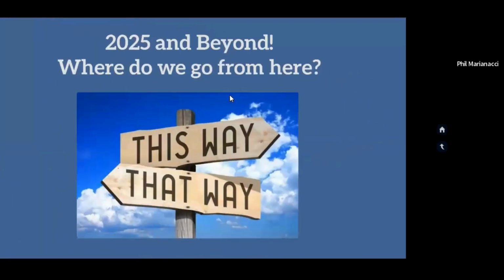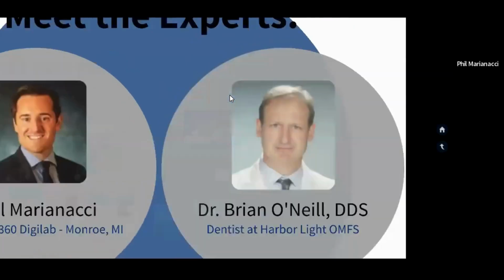Okay, so what am I looking to do in the future? I'm looking to integrate things that will attract doctors' value. It's as simple as that. It might be communication, which is huge, right? Being able to teach and educate. We're going to be doing more of those things that will help attract and partner with our clients. So that's essentially our core and what we're looking to do.